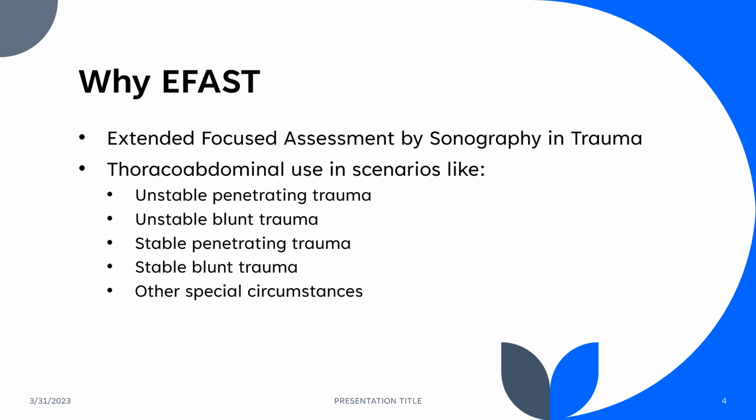So why do we use EFAST? Some time ago, the FAST exam was quite popular, and as it gained traction in clinical sites, they found that they could extend that FAST exam beyond just the abdomen and utilize it to evaluate the heart and the lungs more thoroughly in trauma situations.